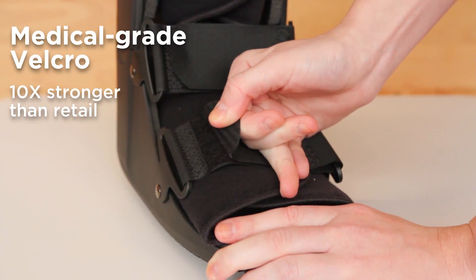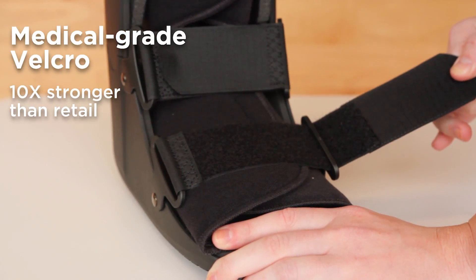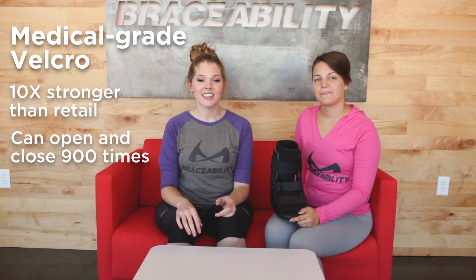Another feature that you might notice when applying this boot is that the velcro straps are much stronger than most. That is because these are medical grade velcro straps which are 10 times stronger than the retail grade velcro you'll find on braces at Target, Walmart, or your local drugstore. Medical grade velcro is meant to open and close 900 times, unlike retail grade velcro which is only meant to open and close 90 times.